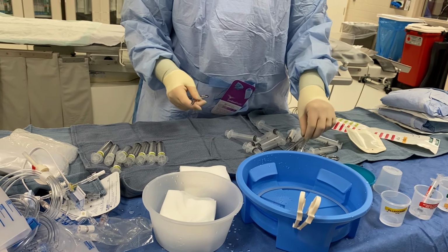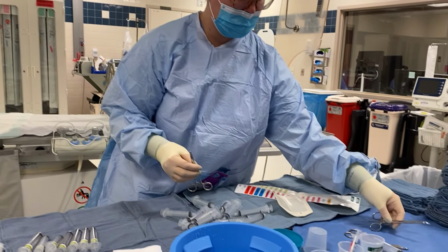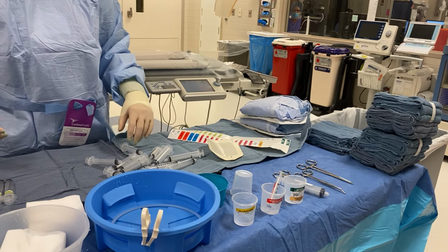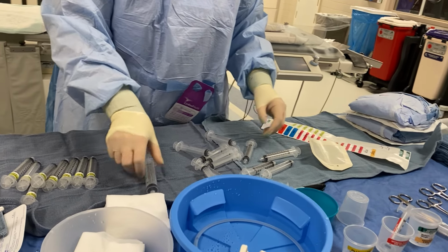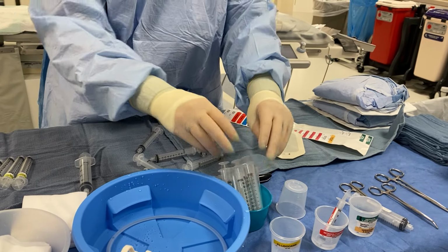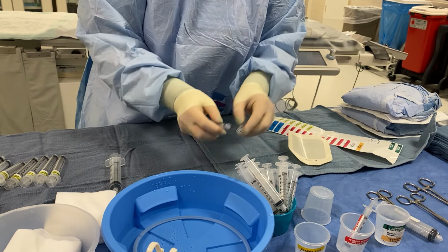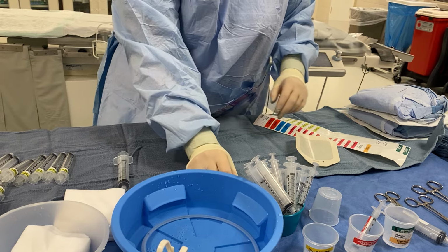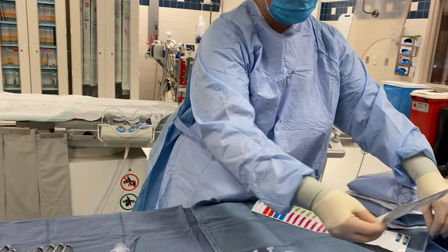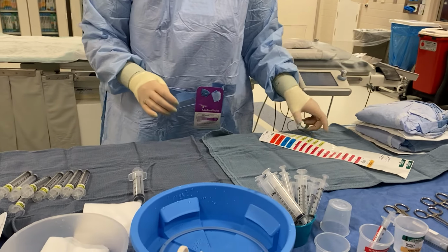And then any remainder supplies, our pack comes with some scissors and Kelly clamps. I'm gonna set those up to the top so I can access them if needed, but they're out of the way during the procedure. And then this pack comes with a lot of extra syringes, which we don't need, so I'm just gonna set them aside for now so I can grab them if I need them. And then we have a tegaderm, which I like to keep dry if at all possible, and the best way to do that is to just stick it right underneath the towel. But as long as you know where it is, you can put it under the towel.